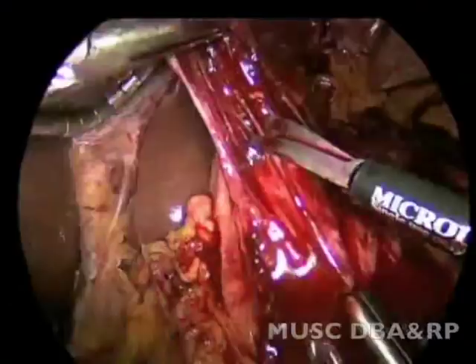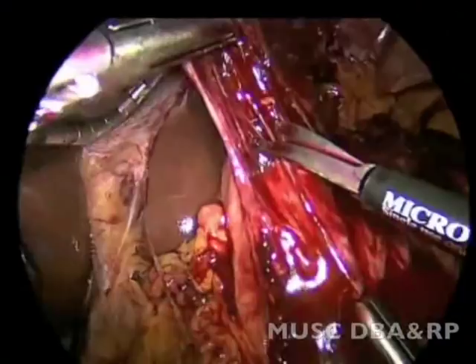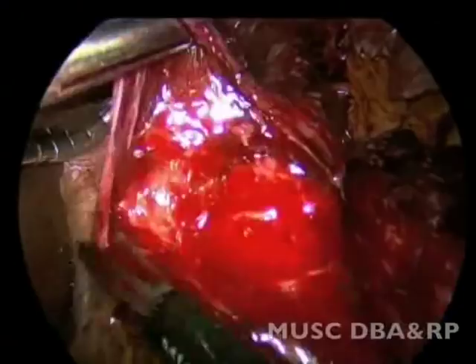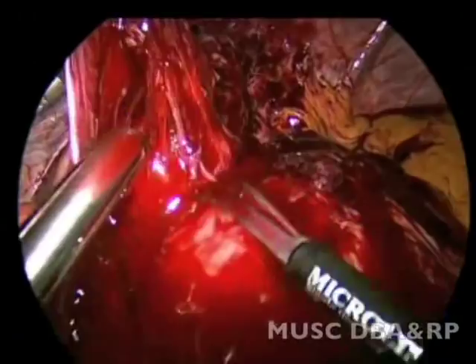There appears to be a slip of the wrap. The anterior aspect of the esophagus is then cleared. The wrap appears to be twisted, which could add to the problem by kinking the esophagus.